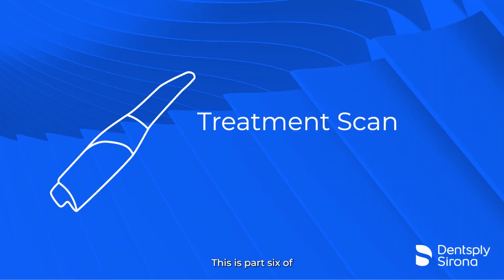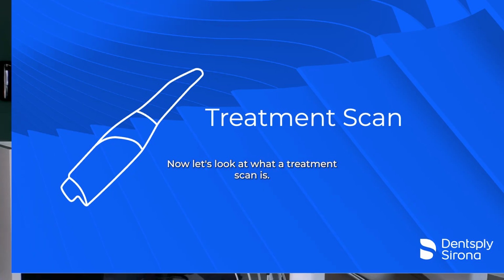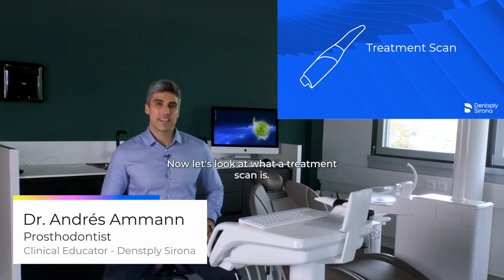This is part 6 of 8 short videos in the Getting Started with Primescan 2 series. In this video, I demonstrate how to take a treatment scan with Primescan 2. Now, let's look at what a treatment scan is.